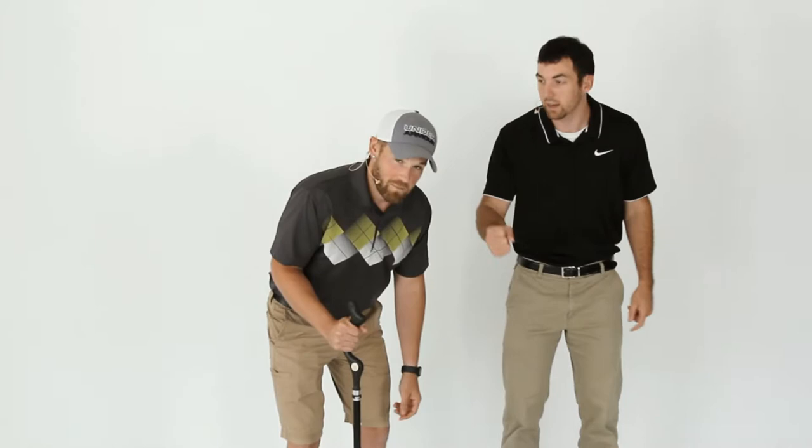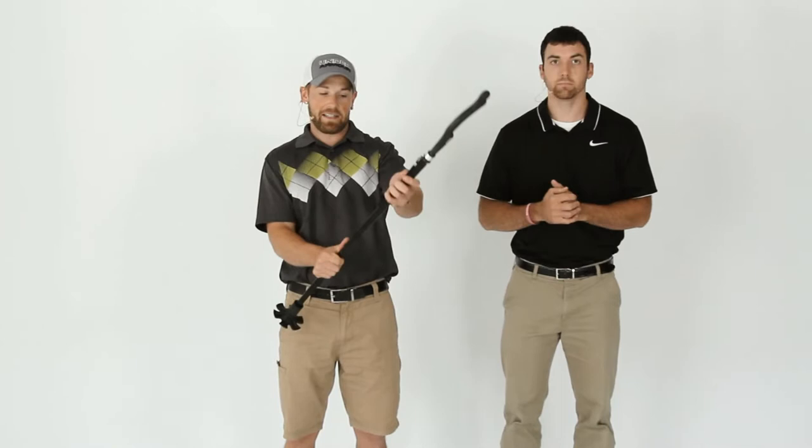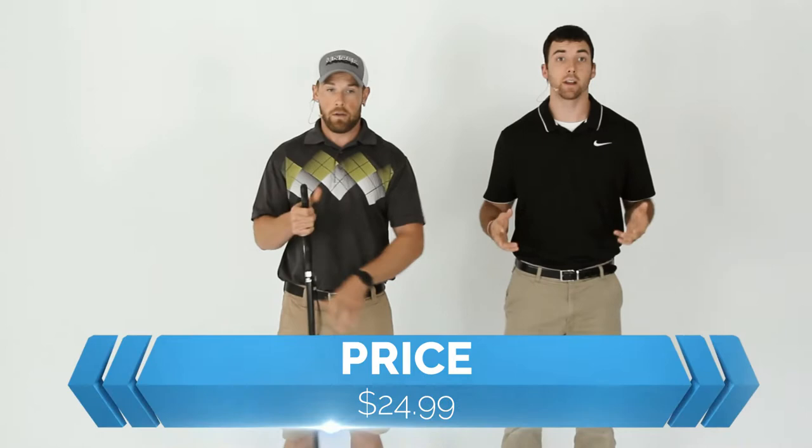How can I fix my posture while using a cane? You see those elderly people — sometimes middle-aged people — using a cane with that bent-over posture. Today we're looking at the Campbell Posture Walking Cane. The word posture is right in the title. Let's talk about the price first: $24.99, about $25. Very reasonable for an adjustable cane.